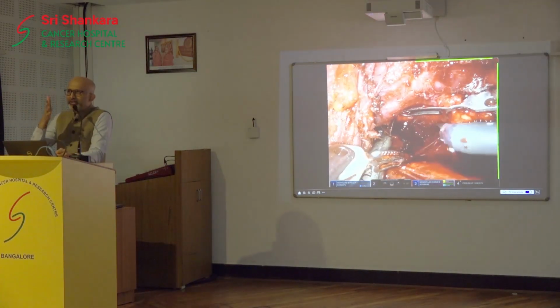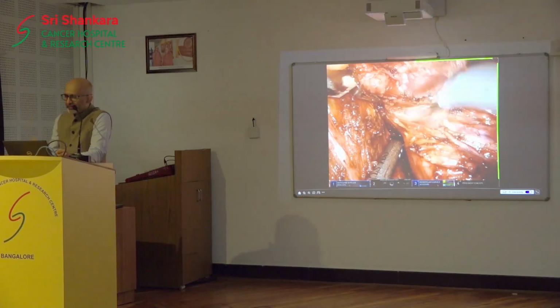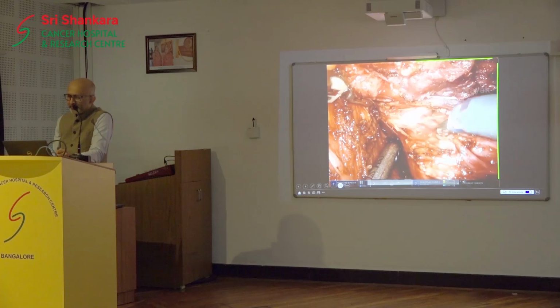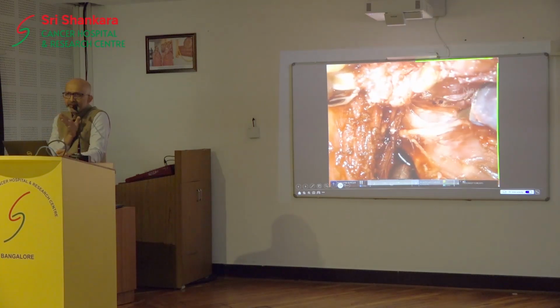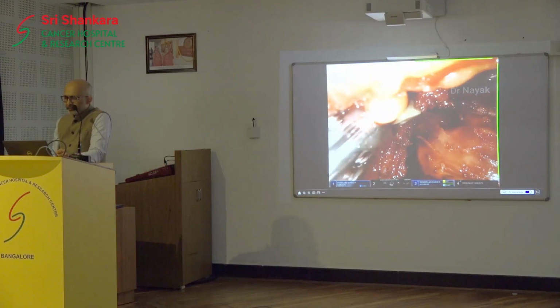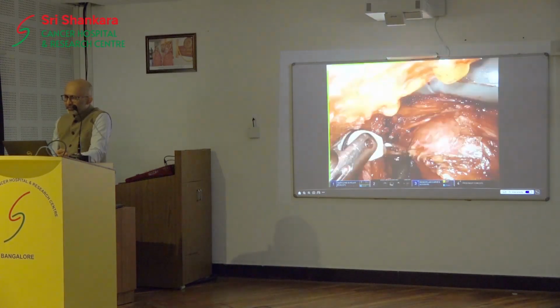In fact, I almost entered the esophagus looking for the recurrent nerve. Then I thought, this is non-recurrent. Went up. This is the nerve. It is entering, I could spot it above. So it was possible to identify. And of course, you have to be cautious.